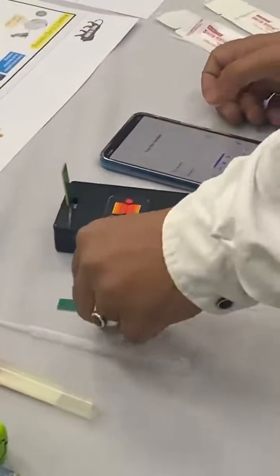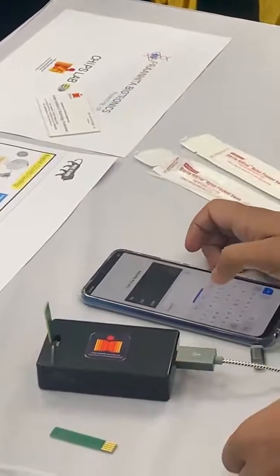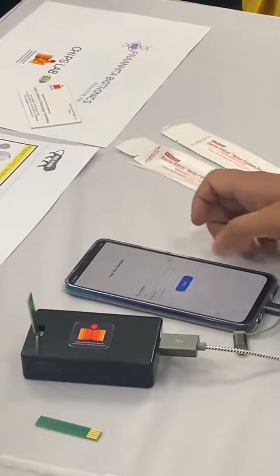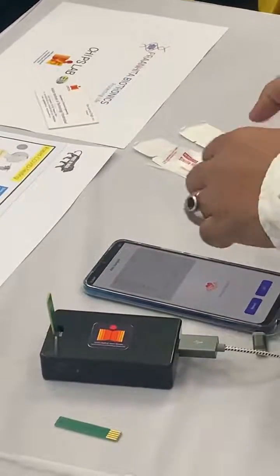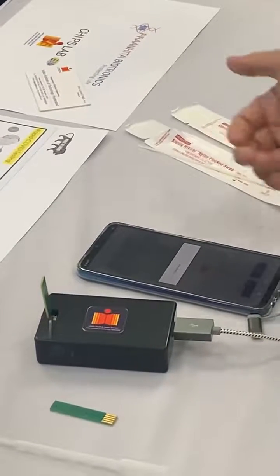So here the chip number is identified with this number. That number I am going to put. We can give any number to the chip, and a unique ID is generated for the patient. Then we will paste, and here you can go for the next. After putting the droplets, we have to wait for a certain time, and after that we can go for the testing. Once you press the test, it should show the result.